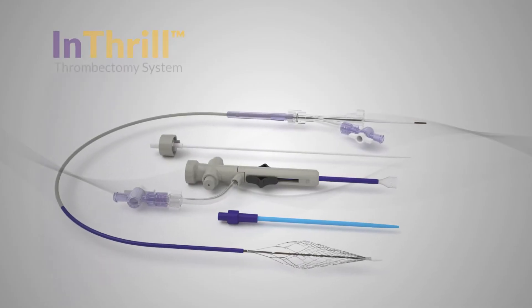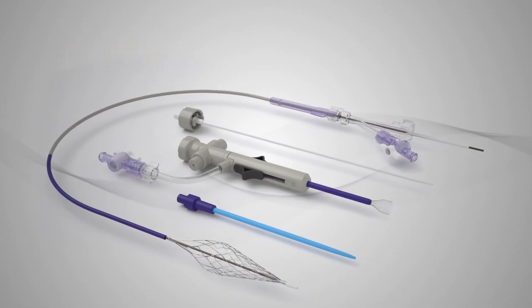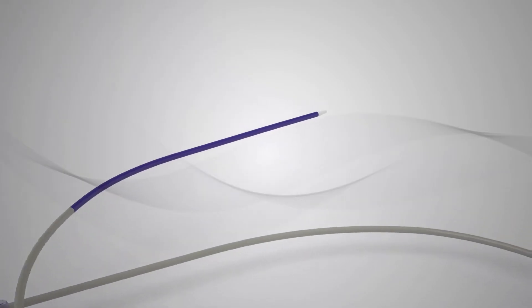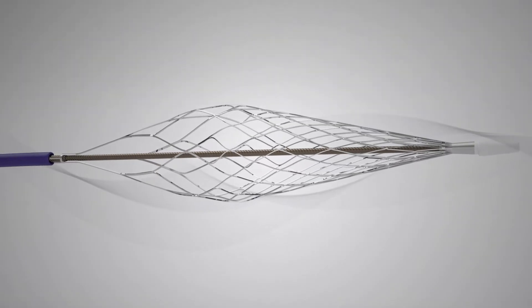The Inari Medical Inthril Thrombectomy System provides a simplified thrombectomy solution for thrombosed arteriovenous fistula and grafts. The 8 French system includes the Inthril Thrombectomy Catheter and the Inthril Sheath, and is designed to maximize thrombus removal and restore AV access without capital equipment.